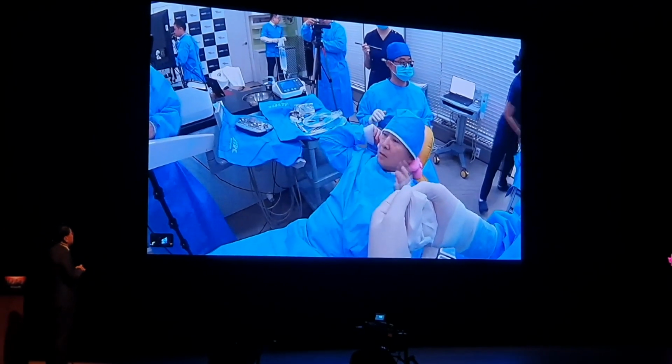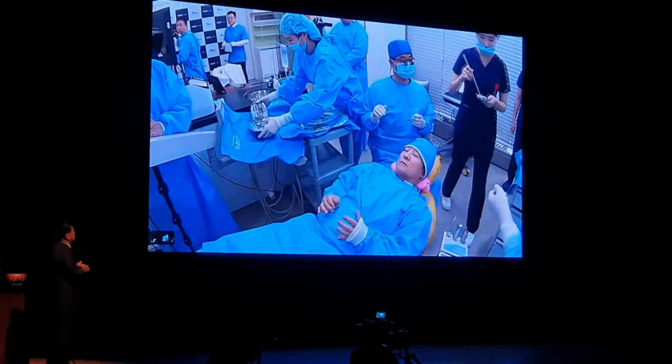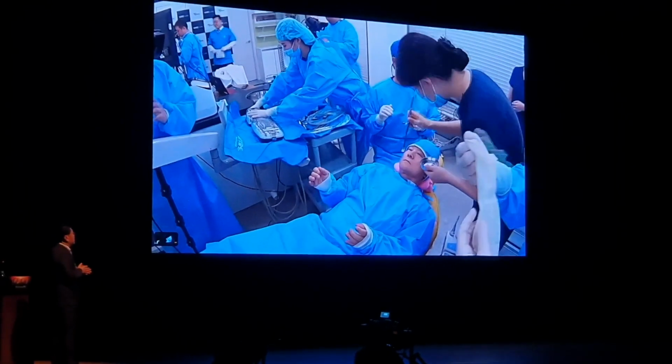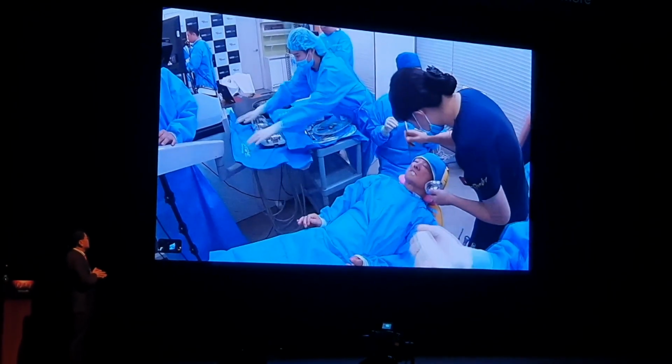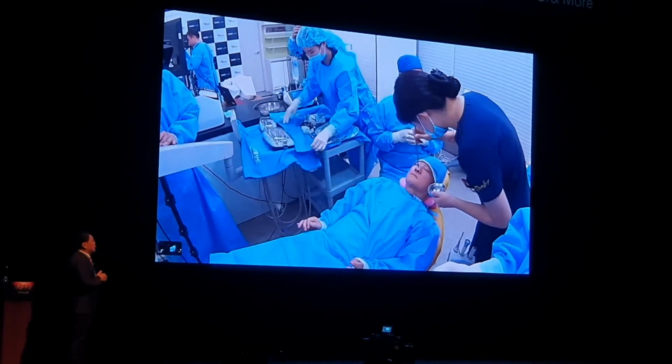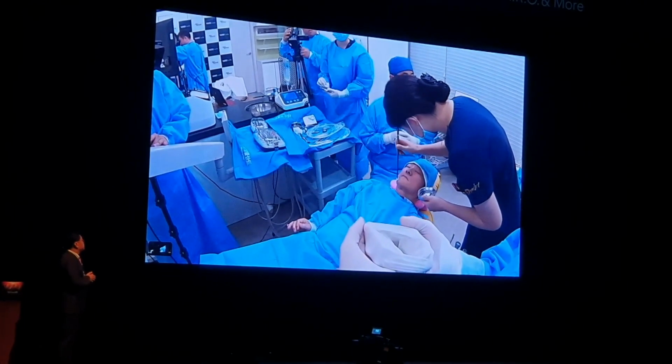So when you're back, now we'll go for the facial disinfection. So they are now preparing for face draping. To control infection, they are using a chlorhexidine solution and swabbing outward for facial skin disinfection.